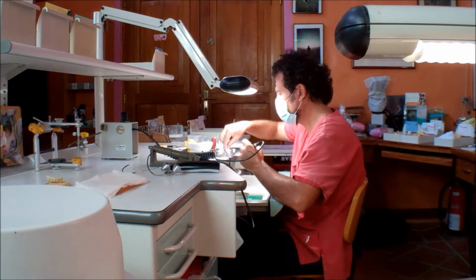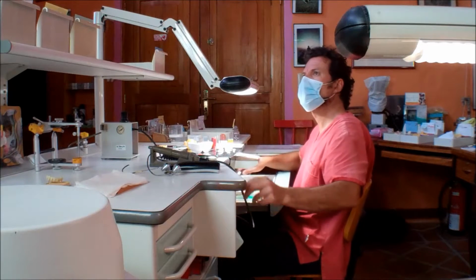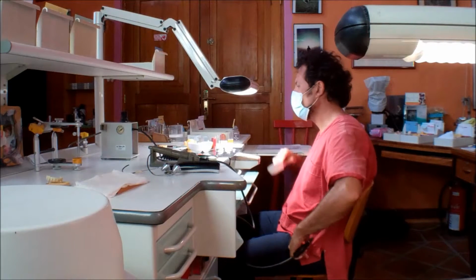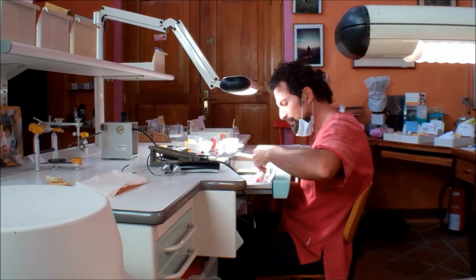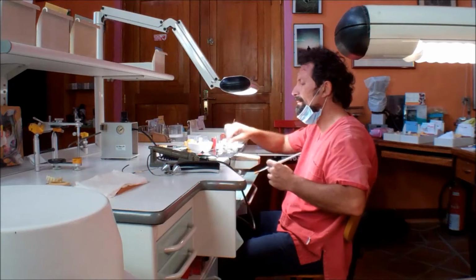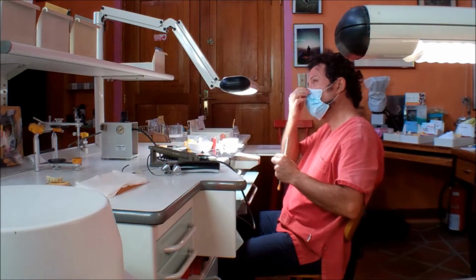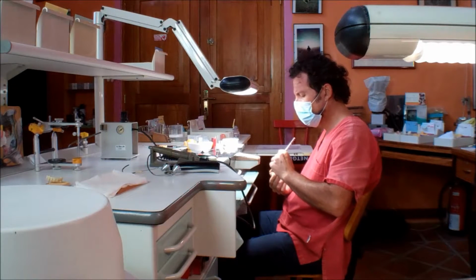One of the things that I've been doing a little bit of research since Dr. Broder and I decided to get this kind of teeth, the full zirconia, the Zirkonzahn. I initially thought we were going to go with porcelain fused zirconia, the PFZ. Yeah. And then he suggested this. But one of the things I heard about zirconia, I know there's different types of zirconia, correct? Yeah.